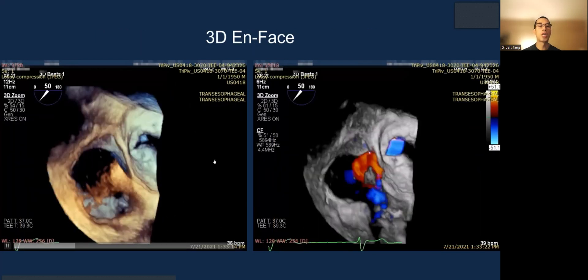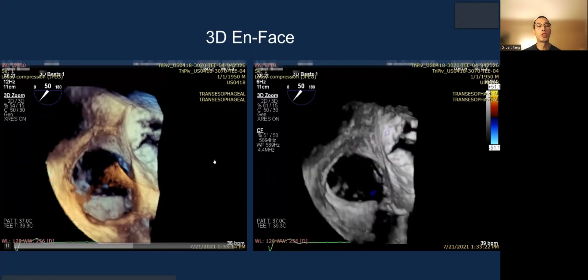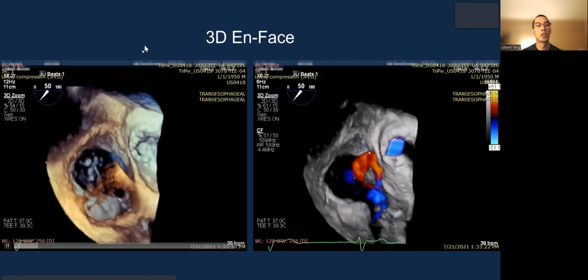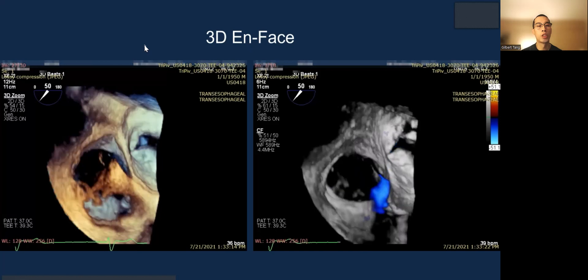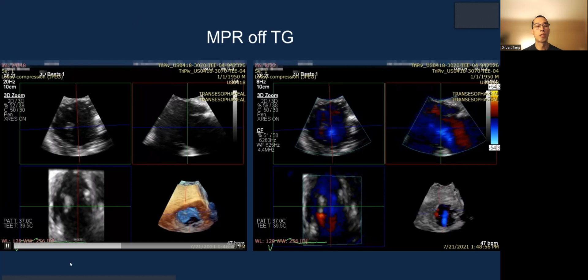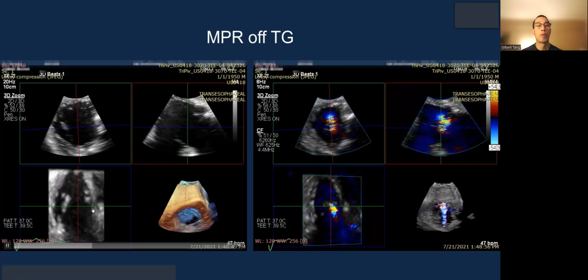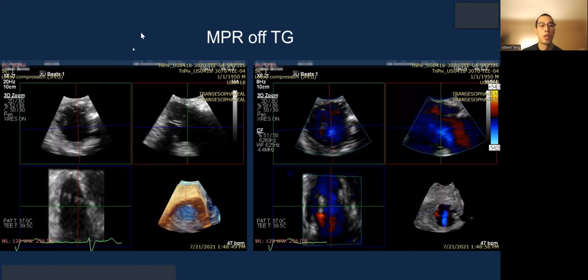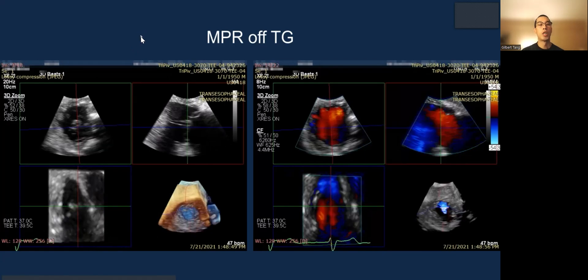3D en-face can be important if you can achieve sufficient imaging quality — you will see how many leaflets there are, where the jet is localized, and the particular location of the leaflets. The 3D MPR of the transgastric gives a grasping view, but you can also do MPR of a mid-esophageal or deep esophageal inflow X-plane view; the orientation of the images will simply be different.